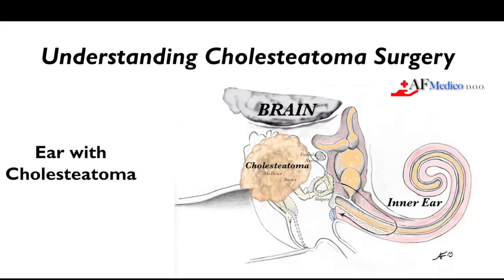Finally, I will show you a video where the posterior tympanotomy is used to perform an incus interposition. All right, let's get started.